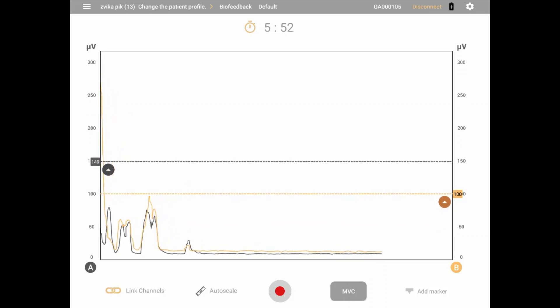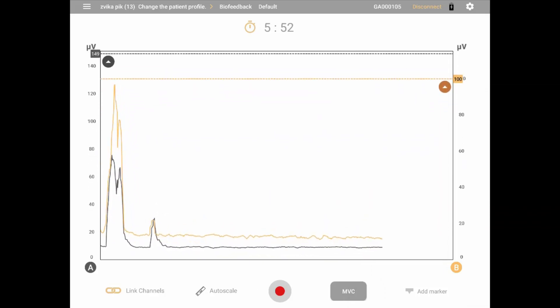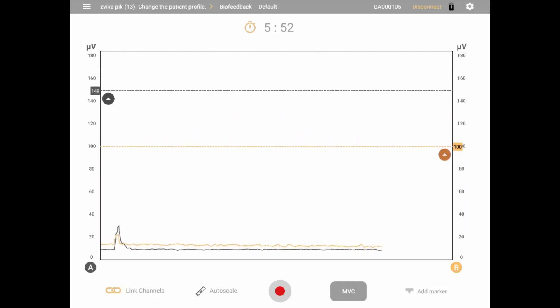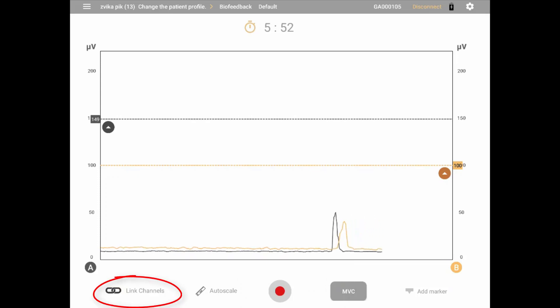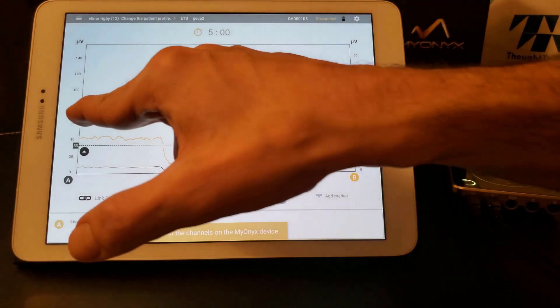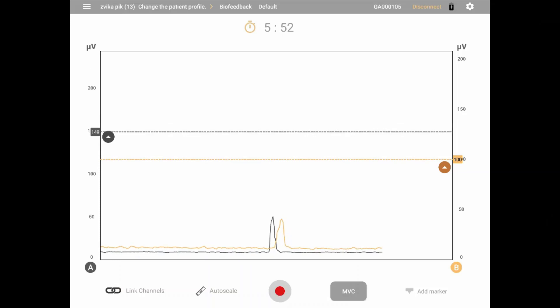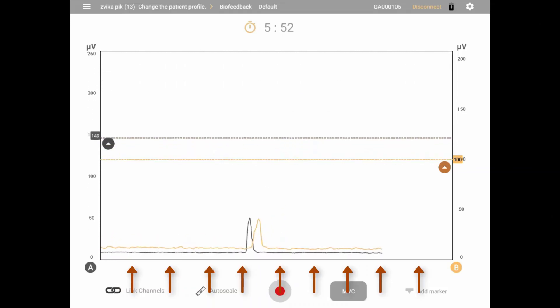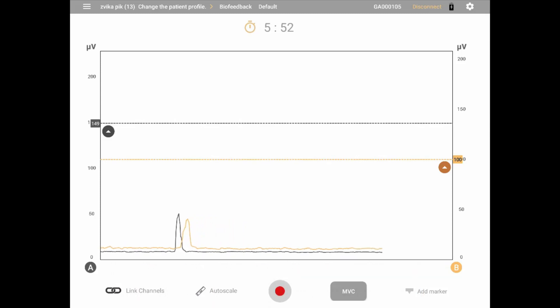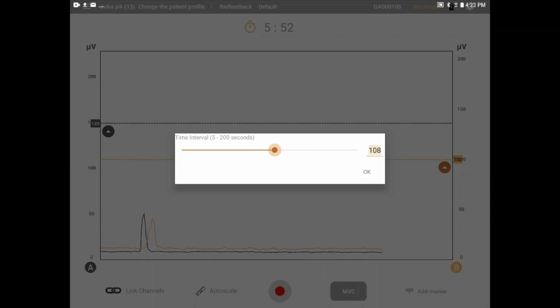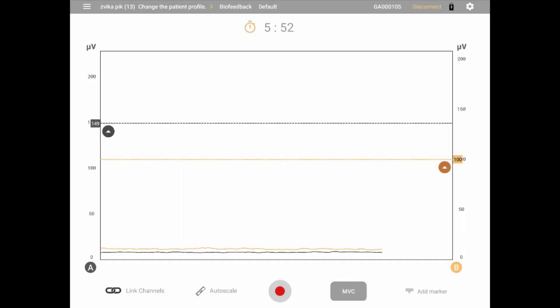Notice the threshold lines must remain in view — you will not be able to zoom in past them. You may also scale the two channels separately by unselecting the link channels button on the bottom left of the screen. Scaling the x-axis is done by touching and holding anywhere on the x-axis line for 2 seconds and releasing. This will bring up a slider to select the amount of time in seconds to display on the screen. Click OK to save and go back to the preview screen.